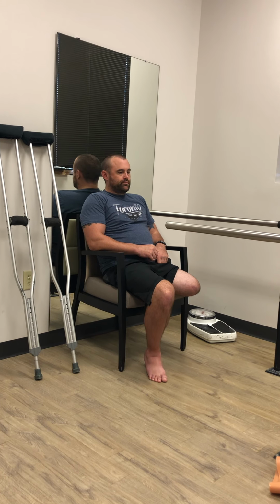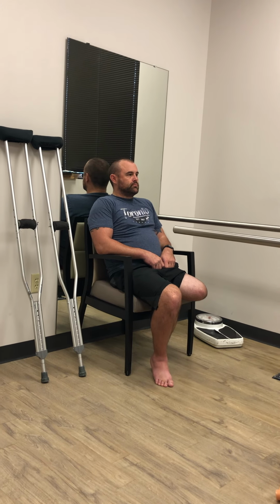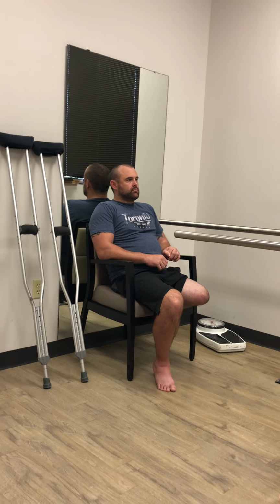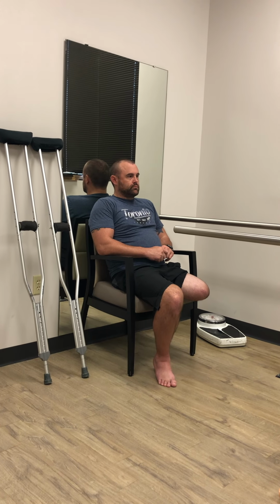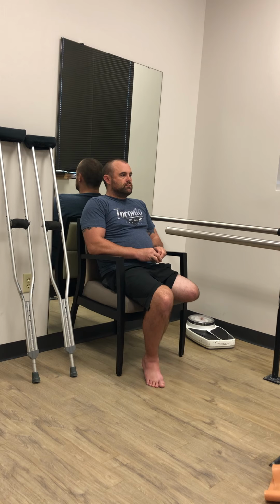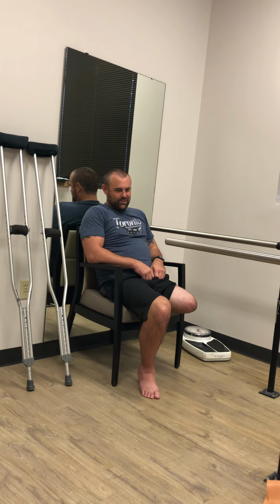Cool. It's also possible to always find a shoe with the same heel height. Even some tennis shoes are different. So we just put you in the shoe, and I can see what your pylon's doing, and then I can make adjustments to your shoe and otherwise, so you can change shoes anytime you want. However, you have to be reasonable with me and not bring me a 2-inch cowboy boot, because I can't help you. Yeah, I can live with that.